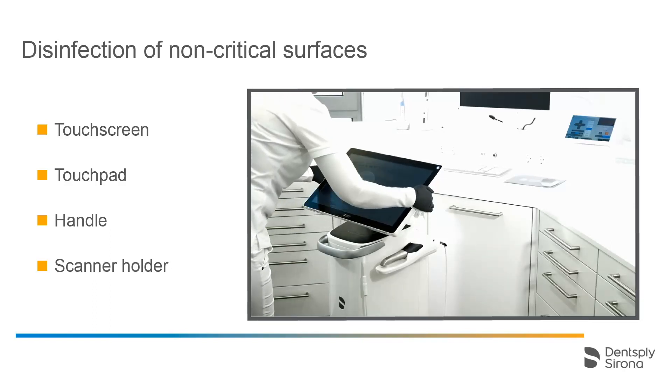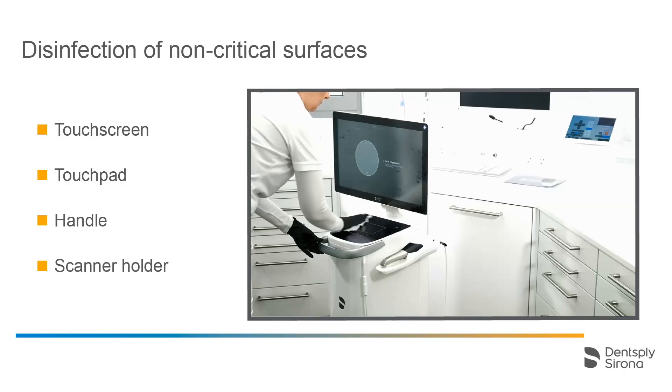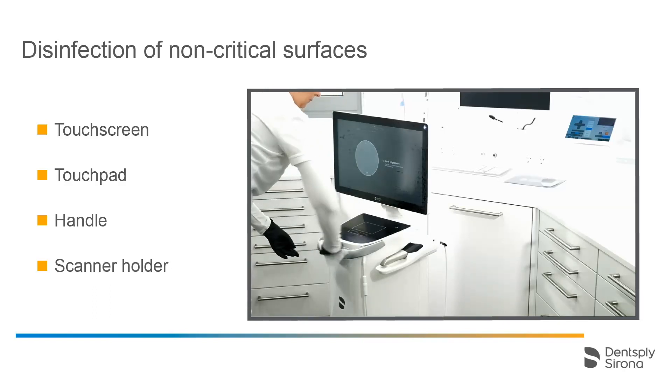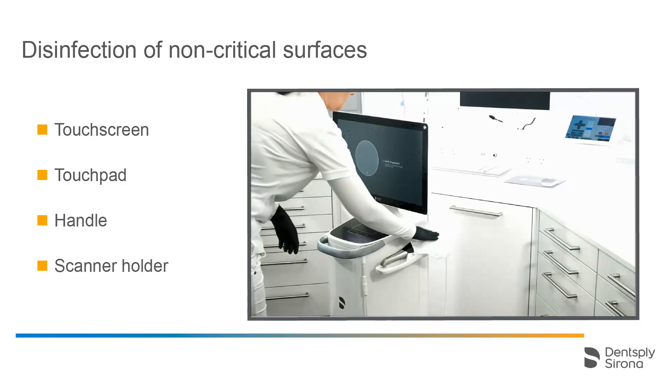We begin with the touchscreen. Then we take a new cloth to wipe the touchpad and the handle connected to it. Finally, we take another new cloth to clean the scanner and scanner holder.